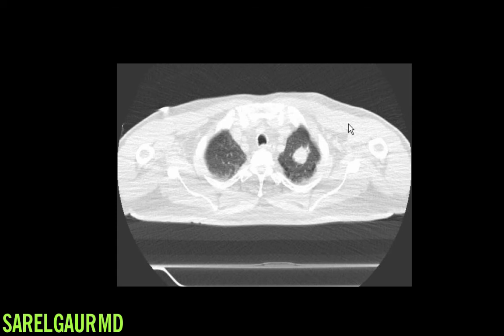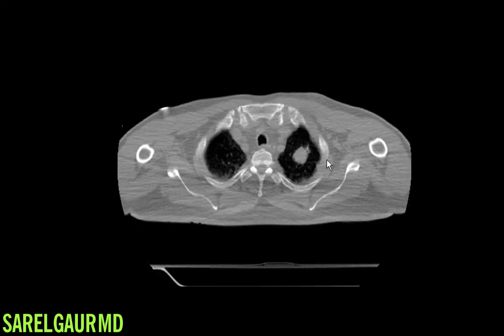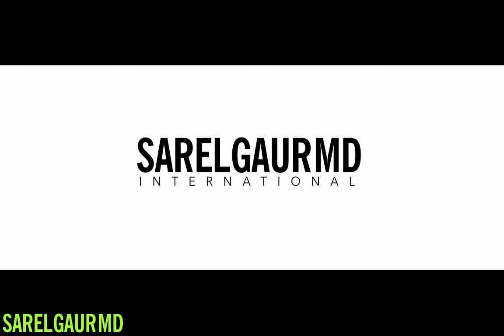We opted for a CT-guided biopsy. This is an image from the biopsy procedure showing successful access of the lesion. From here, cells were sent to pathology, and after a few days, they revealed adenocarcinoma. That is the clinical practice of working up lung nodules — something that radiologists do every single day to find and diagnose lung cancer and help people.